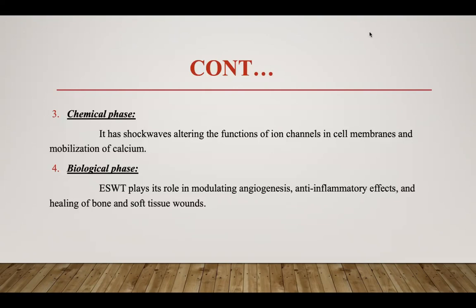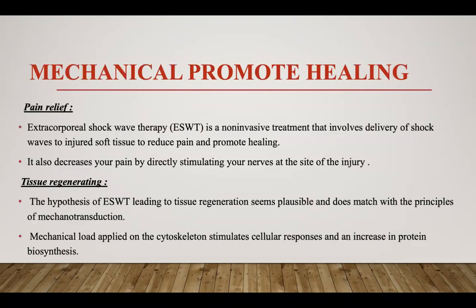Extracorporeal shockwave therapy plays its role in modulating angiogenesis, anti-inflammatory effects, and healing of bone and soft tissue wounds. Now let's move to the mechanism of how it promotes healing through pain relief.